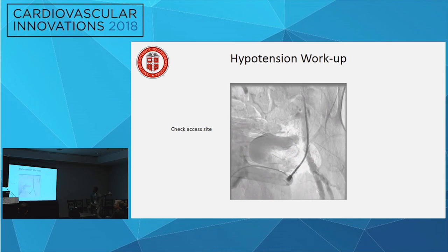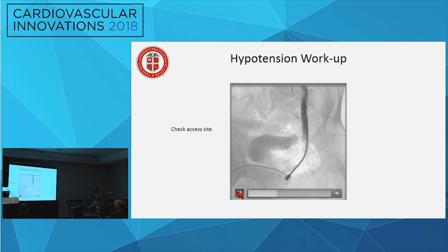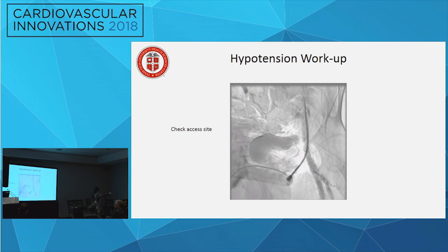All right. So anyone have any thoughts? Was the echo normal? Echo was normal. Yeah. How about the rest of the panel? Can you play that again? Not sure if the lateral does look a little sort of spliced to the side, but there used to be fluid there, but I don't see any fluid coming out. So retroperitoneal.